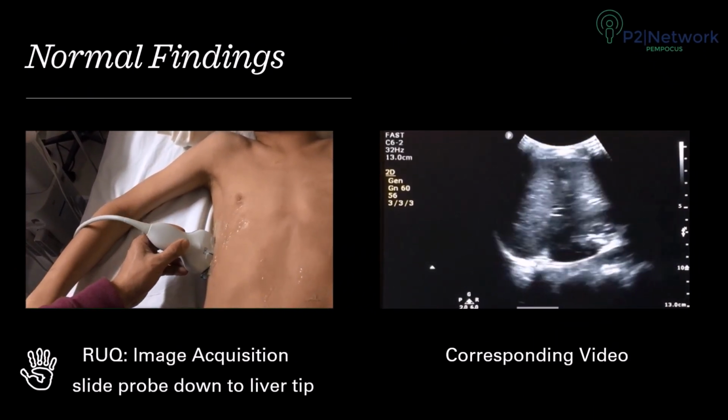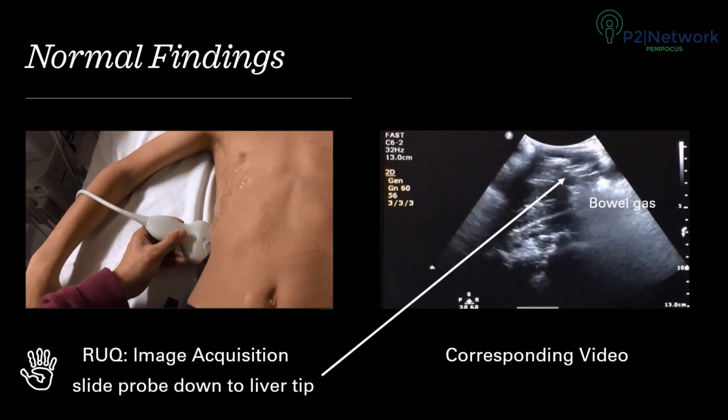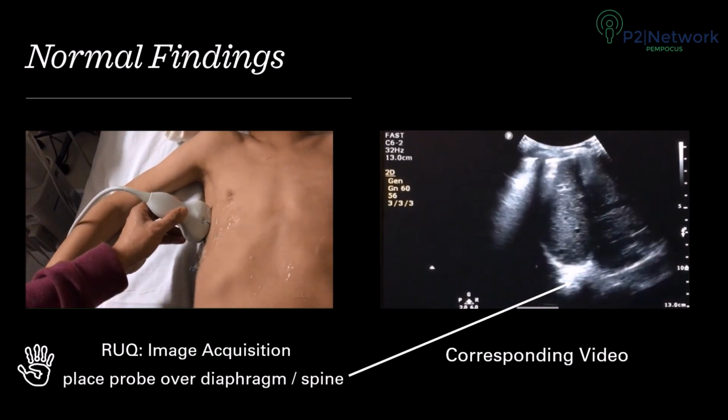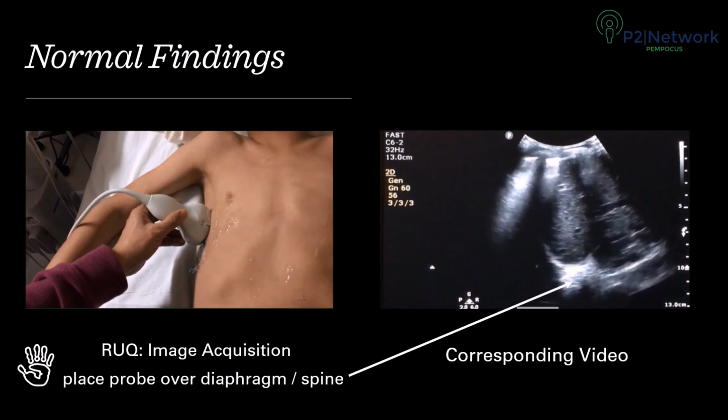Slide down on the patient's body to get a good view of the tip of the liver. Look at the spine to see if it extends above the diaphragm, which would be suggestive of a hemothorax.